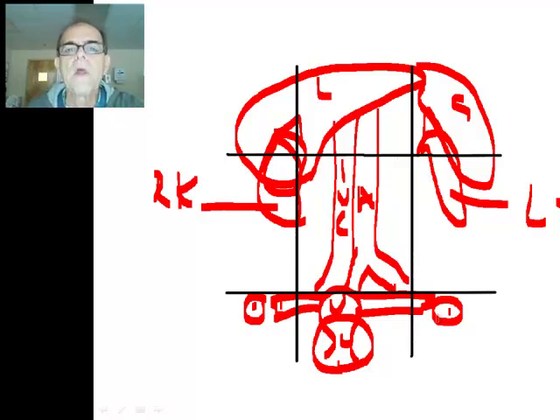But remember, when you have one organ in a region, that doesn't tell you that you must scan the organ from the same region. You have the liver and you can scan the liver from another position. You can even scan the liver from the thoracic cavity through the intercostal space.